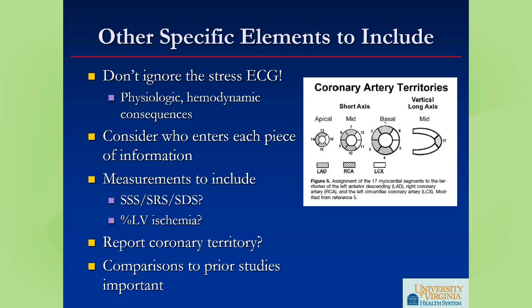But I think you get into trouble if you start waxing poetic on inferior versus inferolateral defects and whether they represent RCA versus OM lesions and such. It's also really important to compare to prior studies.